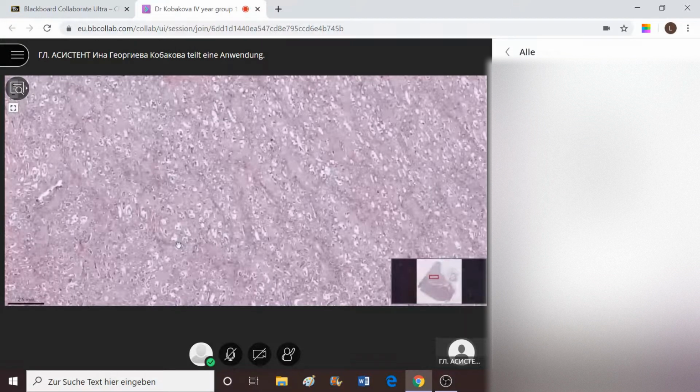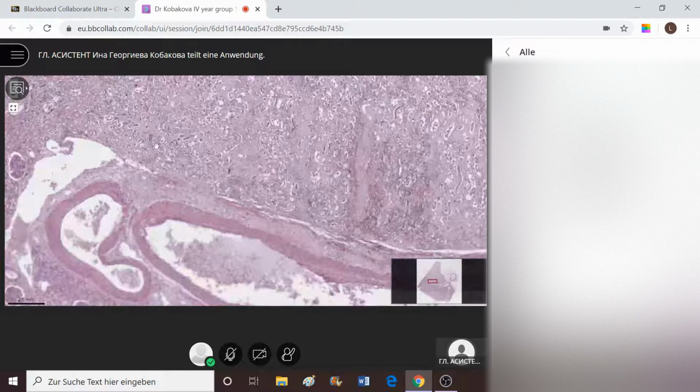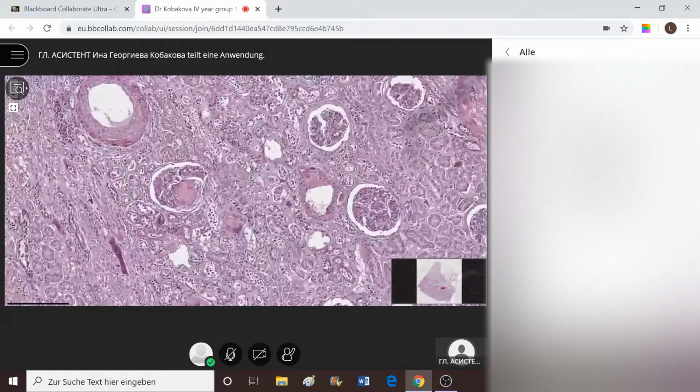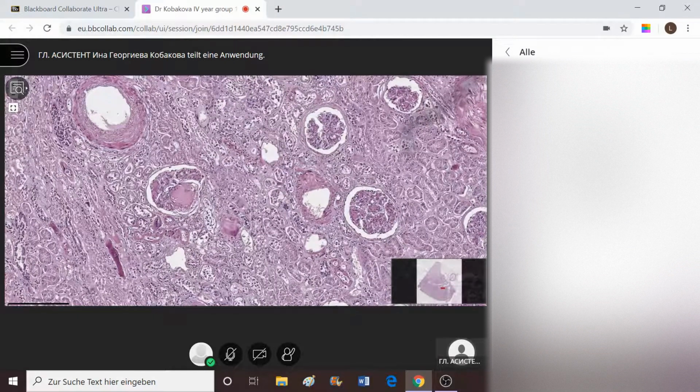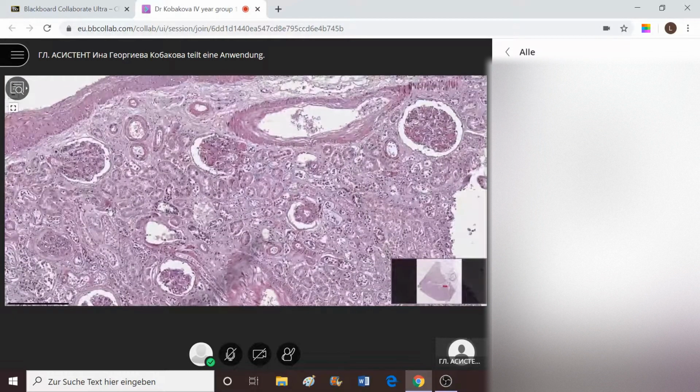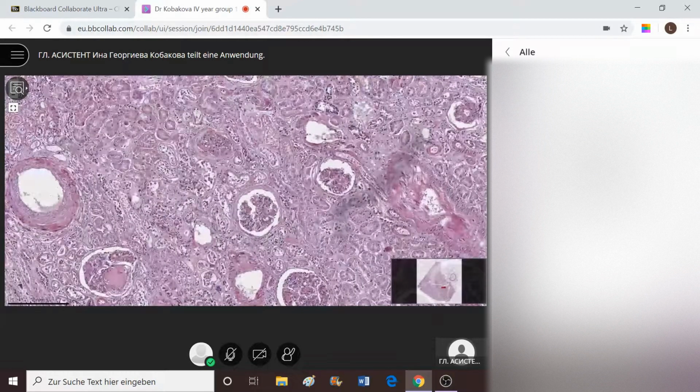Later, we continue with the glomerular structures, which have some inclusions inside the capillary loops, which are eosinophilic, globule-like, and you can see that they appear in multiple places. Here one, here and here. Here also, let's see a more evident one. This one is best observable.